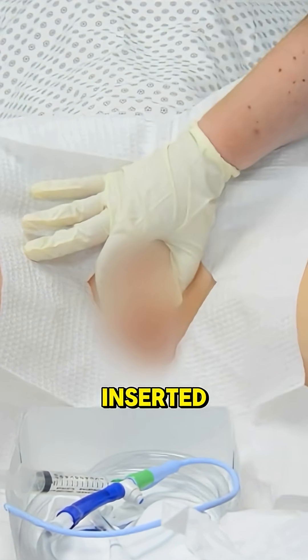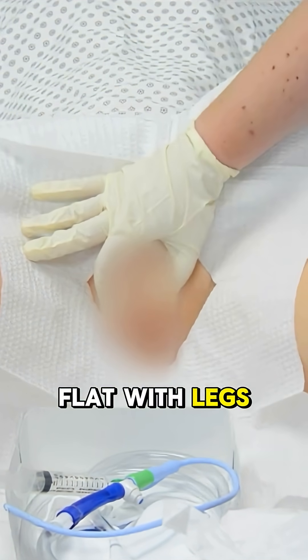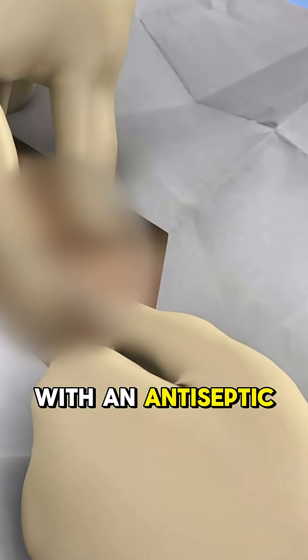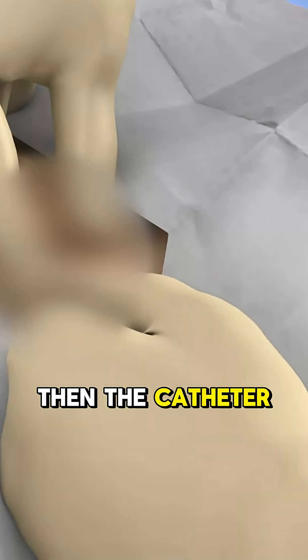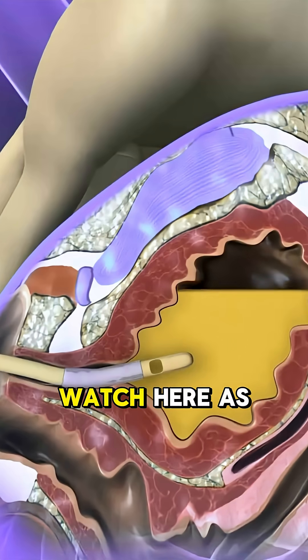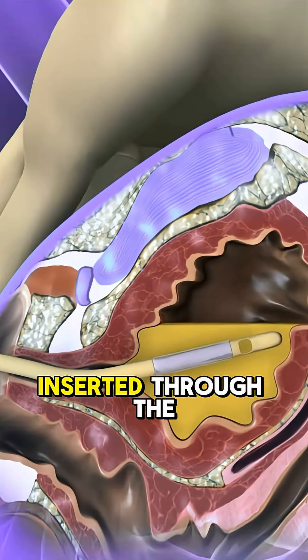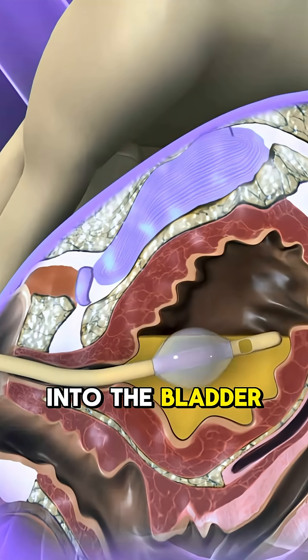Here's how it's inserted: the patient lies flat with legs apart. A nurse cleans the urethral opening with an antiseptic. Then the catheter tip is lubricated — watch here as the animation shows the step. Carefully, the catheter is inserted through the urethra into the bladder.